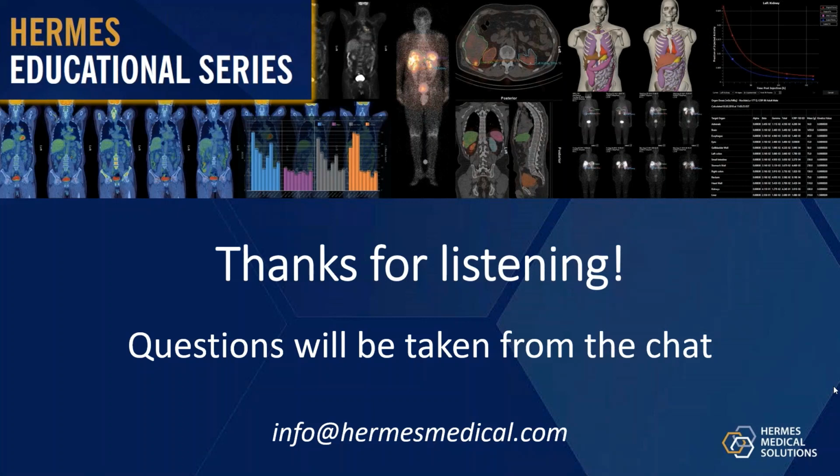So I think that bone SPECT CT is one good candidate for the anatomical prior information, and of course there are not SPECT MRI scanners available, but there are people who are doing these ictal and interictal brain SPECT and MRI studies, and that might be one case where the anatomical information from MRI might be helpful.